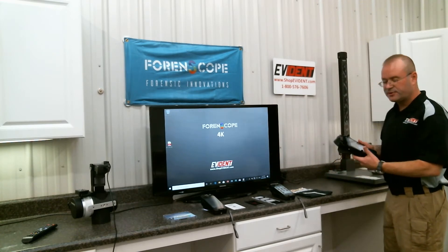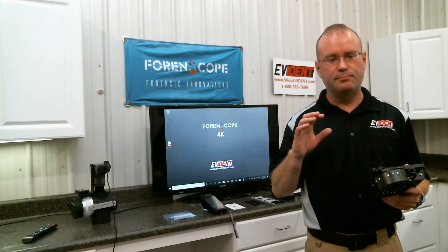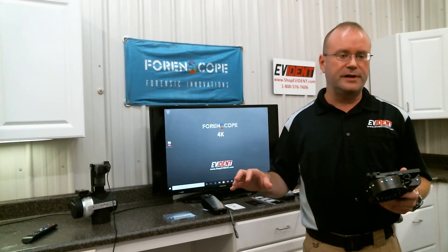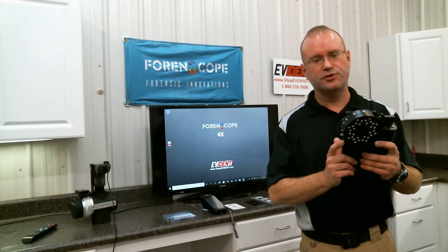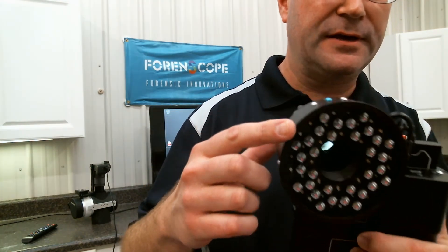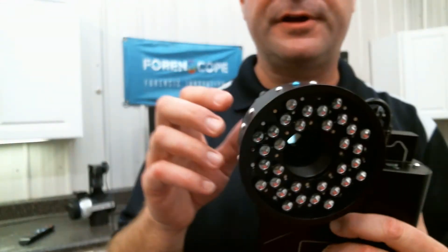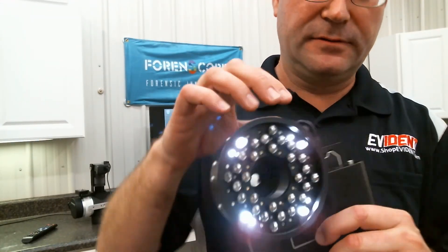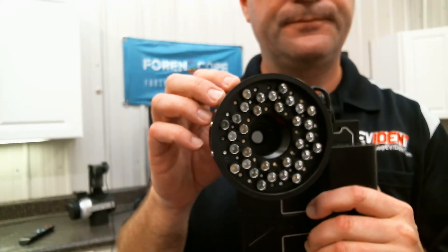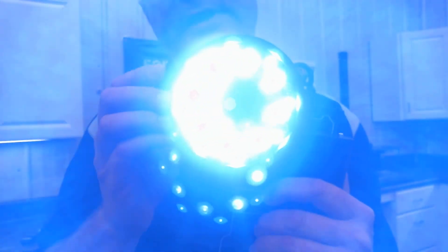The Forenscope tablet is very similar to the CSI Pro smartphone in that it has the visible light capability and the blue light capability for treated fingerprints. But the most special part about the tablet is its infrared capability. It is an Android tablet in a metal housing with an external battery, light source ring, and easy-to-operate light source settings. I have white light, UV, violet, blue, and infrared.